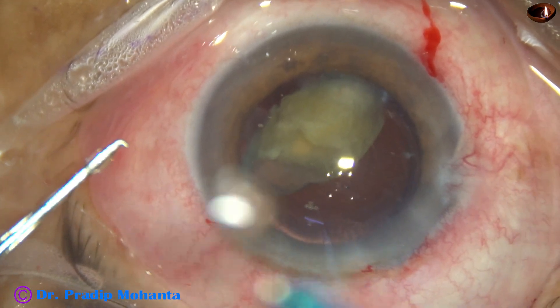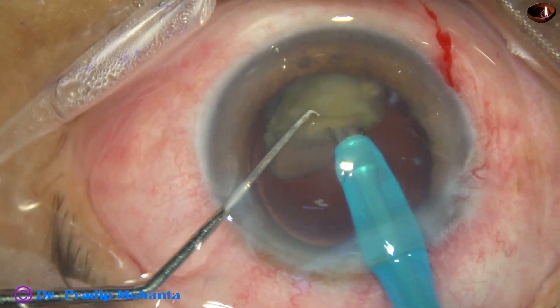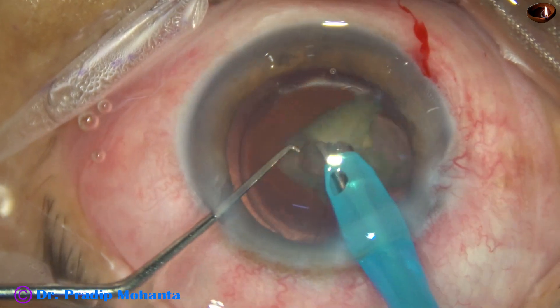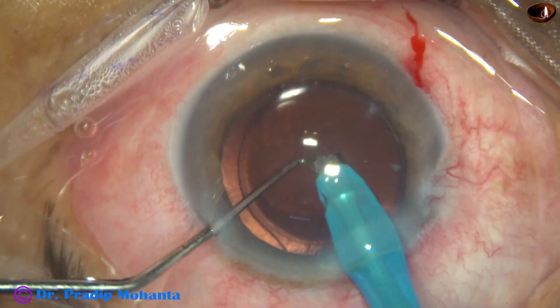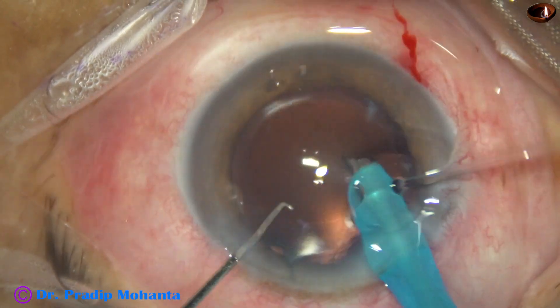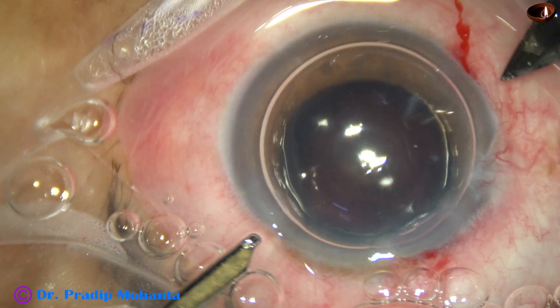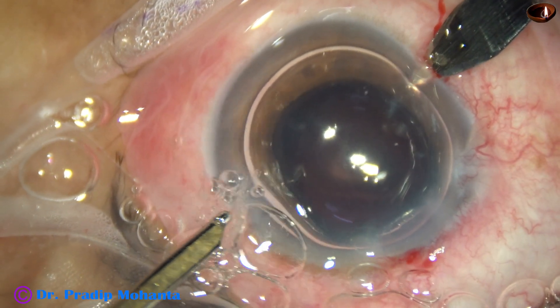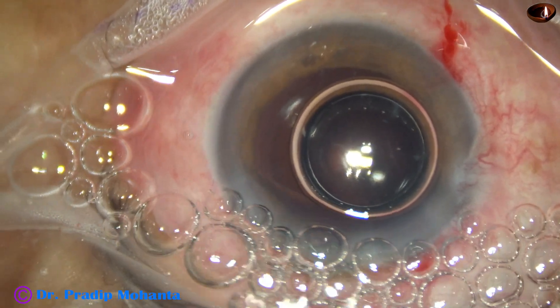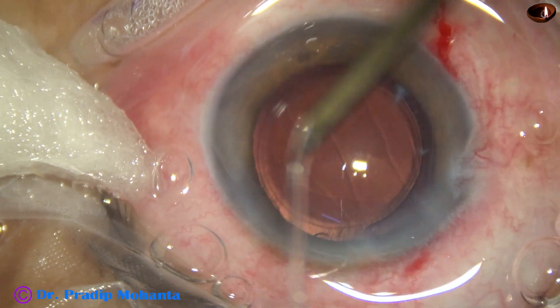And I go again with the handpiece. The safety measure at this stage: the tip of the phaco needle has to be kept at the center — the tip must not touch the corneal endothelium; it must be at the center so that it is a significant distance away from the corneal endothelium. And thus the nuclear piece is emulsified. We have taken safety measures at every step — while doing the rhexis and during nucleus management I made a tunnel bevel-down. Why the air bubble? The anterior chamber collapsed, and just to maintain the anterior chamber we can place an air bubble instead of viscoelastic, because if we put viscoelastic we have to spend much more time to clean it, but with an air bubble it is just a second to remove it.